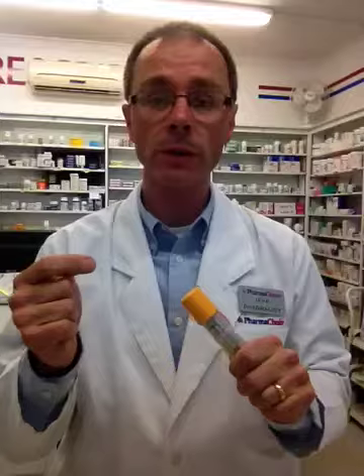Hey guys, Pharmacist Jeff here. Today I wanted to talk to you about a new epinephrine auto-injector called Allerject. It works the same as EpiPen to administer epinephrine into an individual who is experiencing an anaphylactic shock type reaction to things they may be severely allergic to, like bee stings, peanut butter, shellfish, things like that.